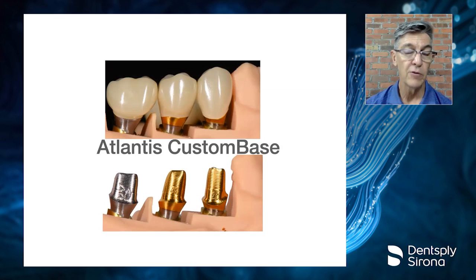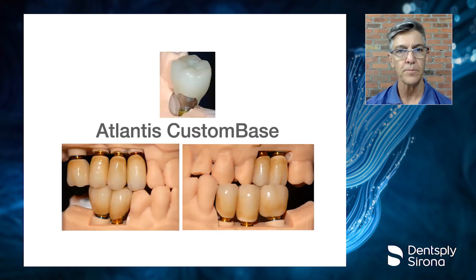Now, generally, I said my default is to do the gold shaded. In the past, I have opted for the gray titanium in the most posterior areas. Today, I will tell you I do everything in gold shaded because if a crown is more translucent, we just want to have a prettier color coming through the crown.